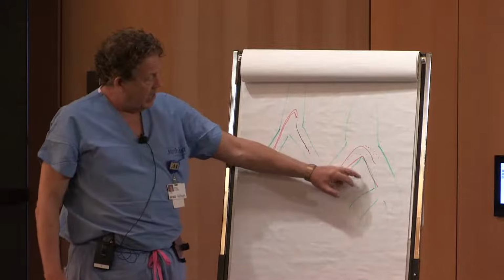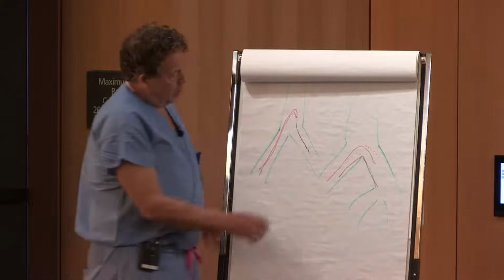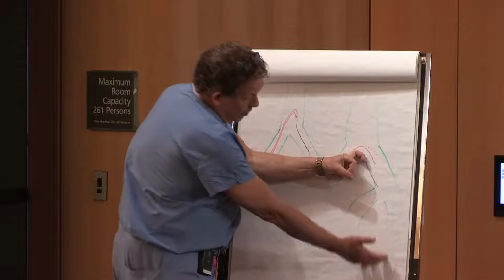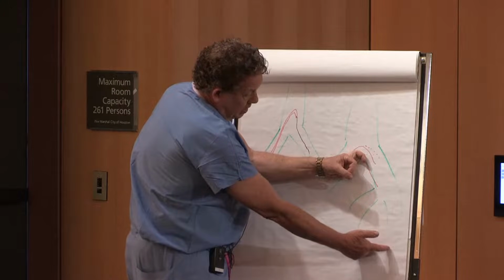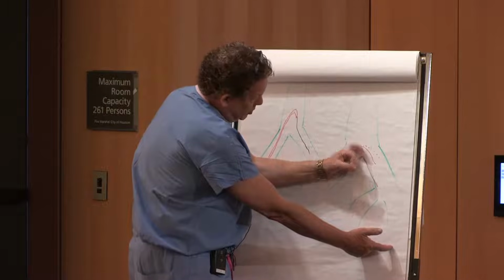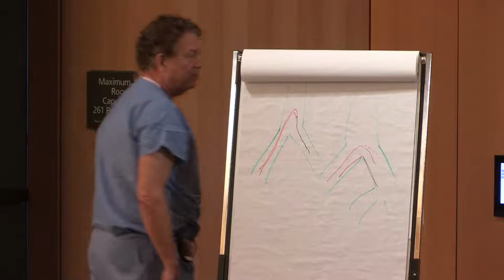And what I will say is keep putting the wire in. Get as much wire in as you can. While you're doing that, you're looking at that catheter, okay? You want to have the whole thing in the field. You want to see where the tip of the wire is. But if all of a sudden the tip of the wire hits something, it's going to start backing that catheter back, and that's when you want it to stop. And there are different ways to try and exchange.